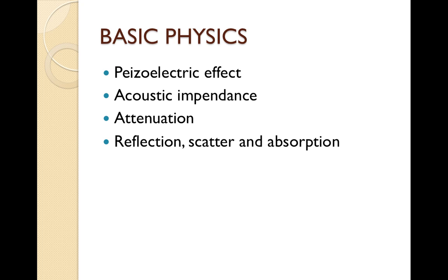The piezoelectric effect is the conversion of electrical energy to mechanical energy by a piezoelectric crystal embedded in the ultrasound probe surface. They convert the electrical energy into mechanical energy in the sound waves that get transmitted to the tissue. The tissue then reflects the wave, and the reflected wave will be converted from mechanical to electrical energy by the piezoelectric crystal, and you can visualize the picture on the ultrasound screen.